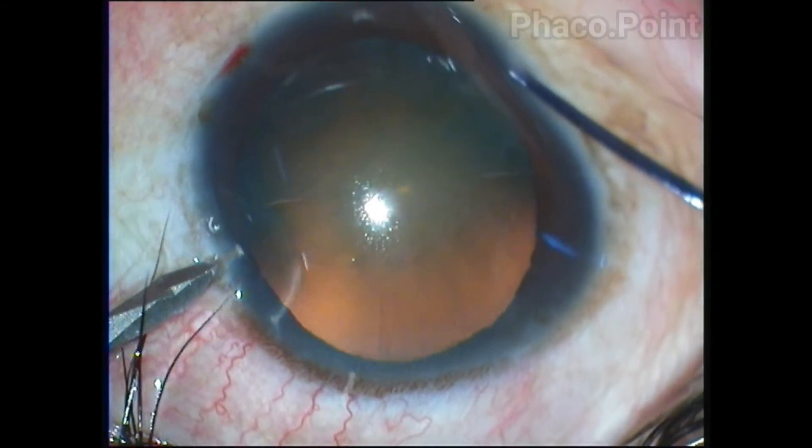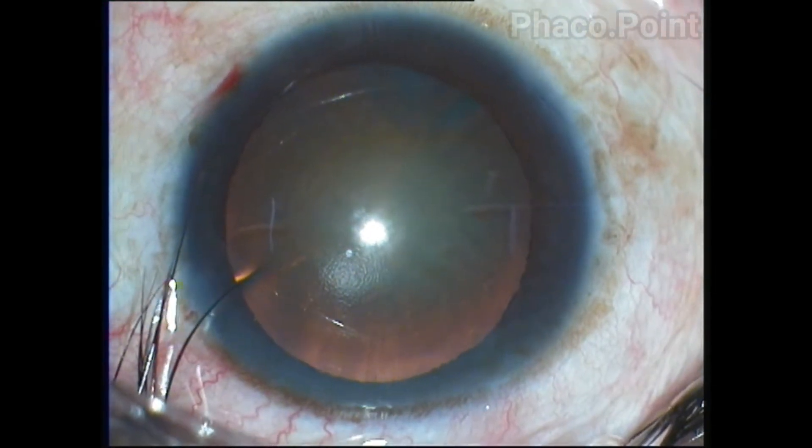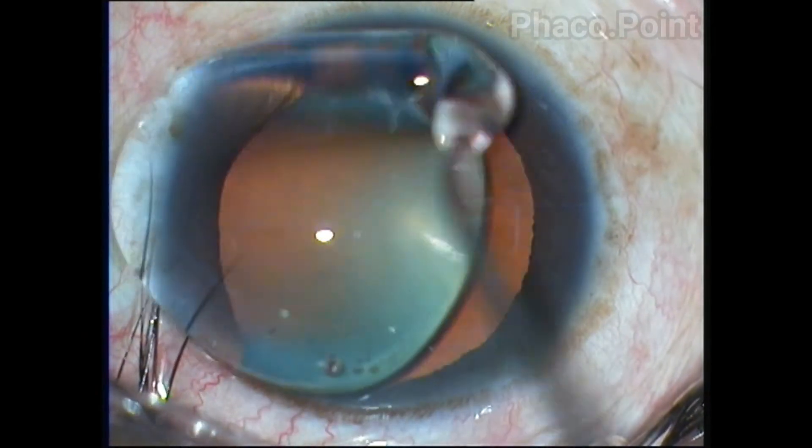A 14 mm long slit beam is important so it will overlap the limbus, and it's also important that you pass through the Hirschberg reflex. Under the operating microscope these marks are pretty clearly visible, as you can see.